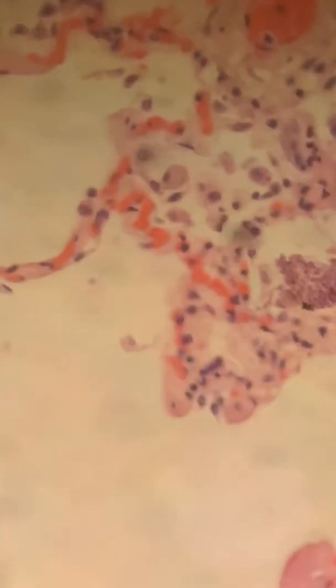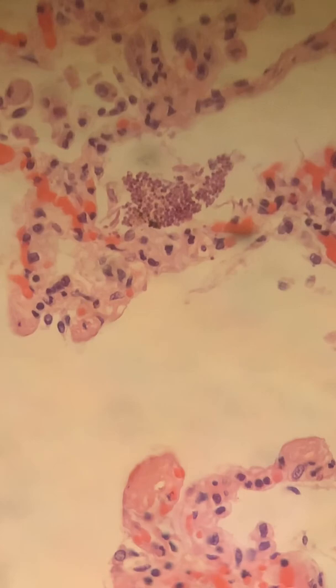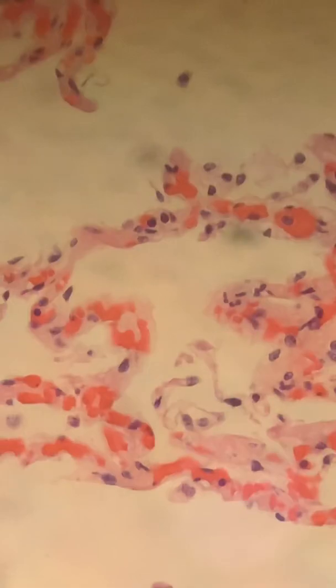But I want to keep on going around until I get a better view of the inflammatory response. And it may not be on this particular image here as I keep scanning around. You see more yeast elements, Candida-like fungal elements there. And this is definitely probably colonized from the mouth that eventually was aspirated into the lung. So maybe it started out as oral thrush, and then developed a pneumonia. But let me go to a different slide that will show more of the inflammatory process.